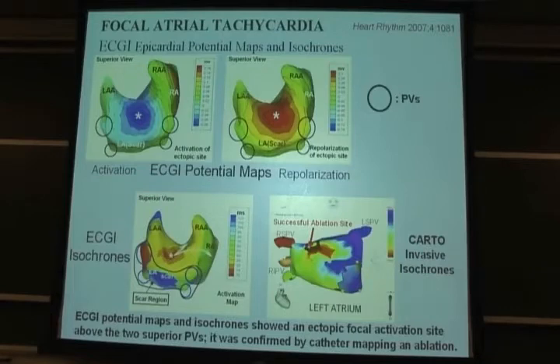This is a scar tissue that was mostly caused by the previous ablations. So ablations can help, but they can also produce substrate that can support arrhythmias. All right? And then Bruce Lindsay went in with a catheter and ablated around this location and at this location, and very consistently, ablation at this location stopped the atrial tachycardia.